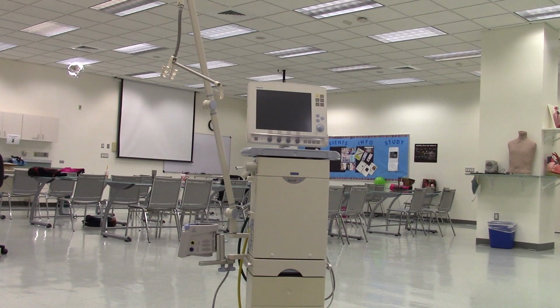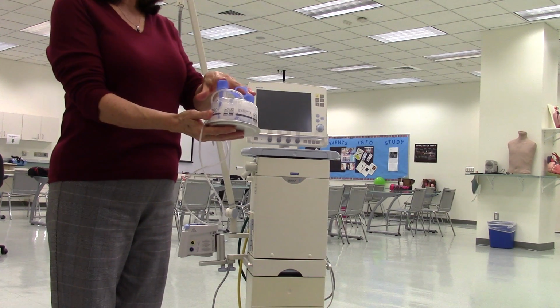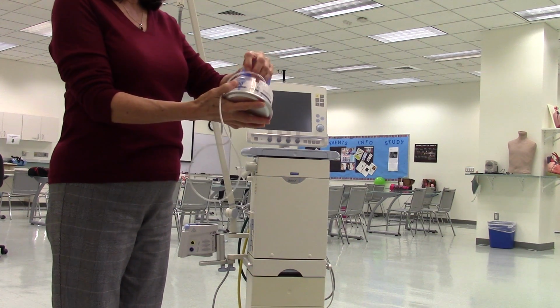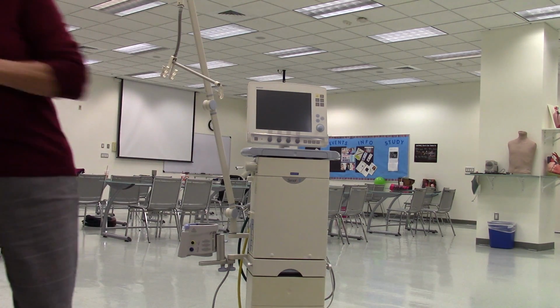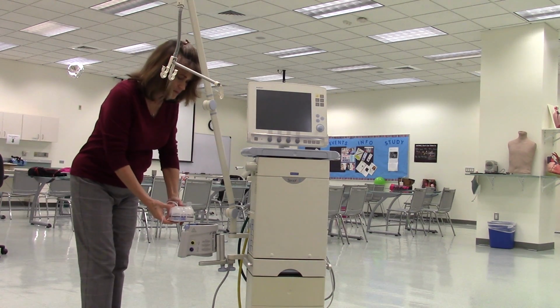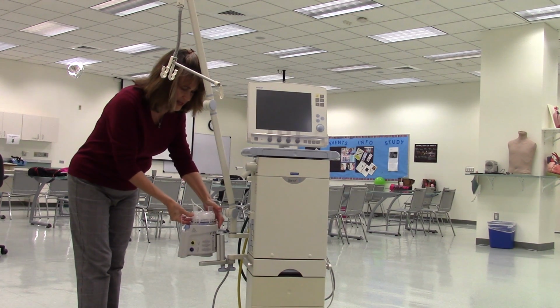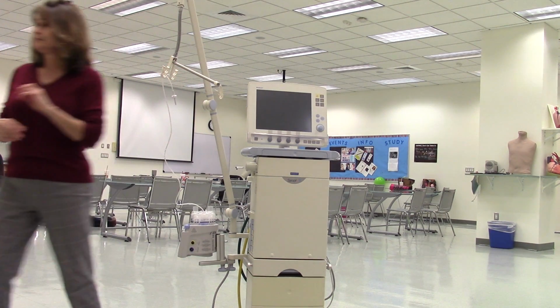All right, so when you open this out of the package, it has these fancy blue caps in there just to hold the float in place, and it's garbage. You just take it out and throw it in the garbage. Oh, okay. Simple. Then it says to connect the tubing to a bag of H2O labeled as sterile H2O for inhalation. All right, so I'll slide it onto the humidifier, and then the bag of water.